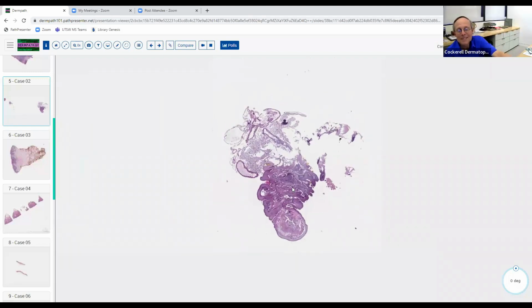Great. All right. So as far as trying to decide what type of biopsy this is, maybe it most aligns with an enucleation. Good. Exactly. So whenever you see something that looks like a little cyst or a little marble sitting there, there's no epidermis.